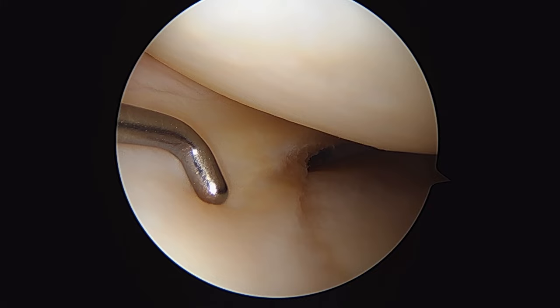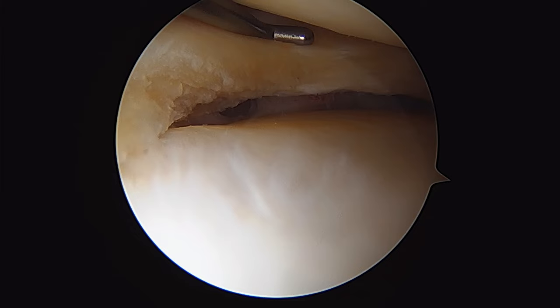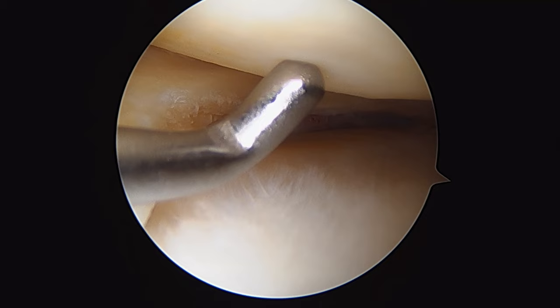Here's a quick look at our final product — the anterior horn of the meniscus here, and we've just trimmed out the torn bit of the body and around into the horn for a nice stable edge of the meniscus, preserving as much of the substance of the meniscus as we can, and avoiding any iatrogenic injury to the cartilage surfaces. So that's a small partial medial meniscectomy.